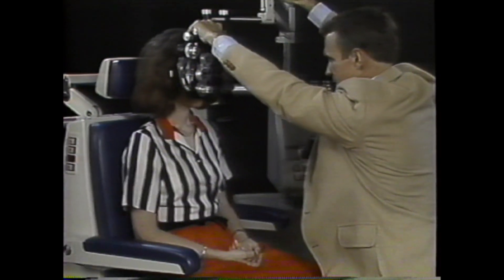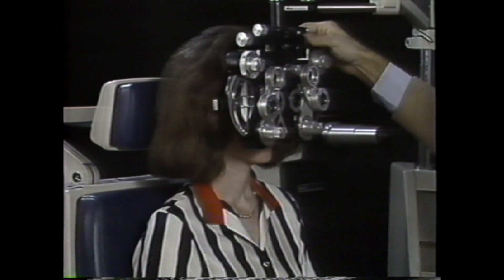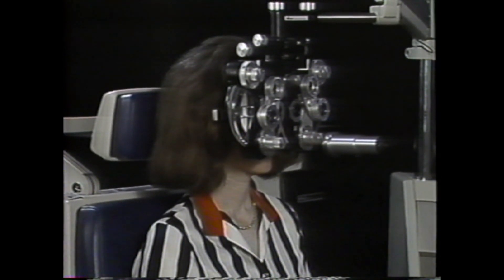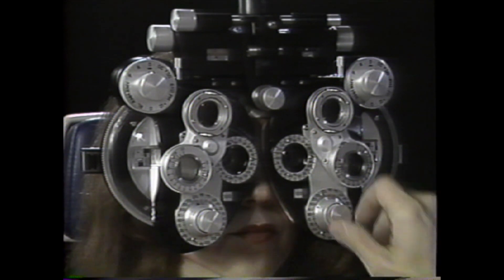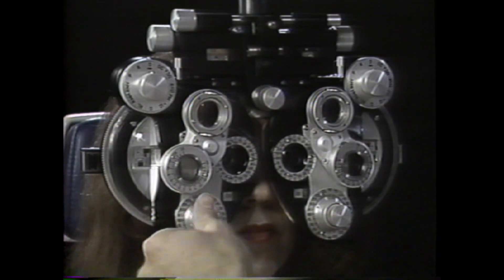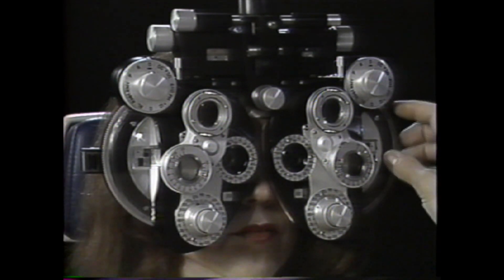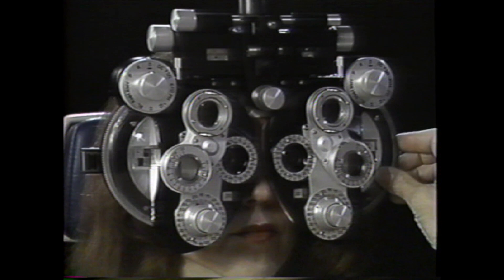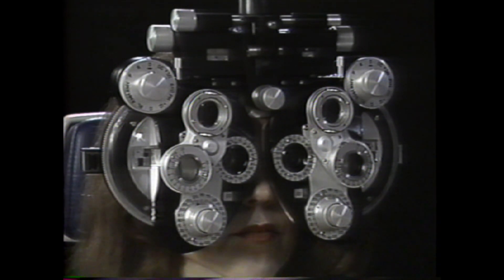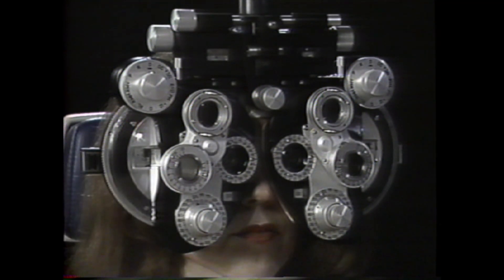Once neutralization of the schematic eye is mastered, it is time to turn to real patients with real eyes. The phoropter is first placed in a comfortable position for the patient with both eyes open and the interpupillary distance set to center the patient's eyes in the apertures. The lens dials are set to zero cylinder and plus one-and-a-half diopters sphere on both sides. The plus one-and-a-half diopters of sphere place the emmetrope's far point at the normal working distance, and this plus sphere power makes most patients myopic, fogging the distance fixation target and tending to relax accommodation. If the patient turns out to be more than one-and-a-half diopters hyperopic, more plus sphere may be necessary for proper fogging.